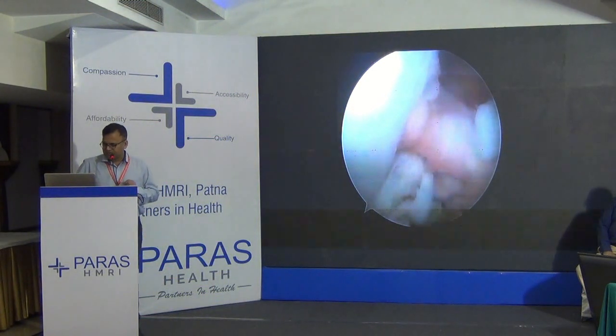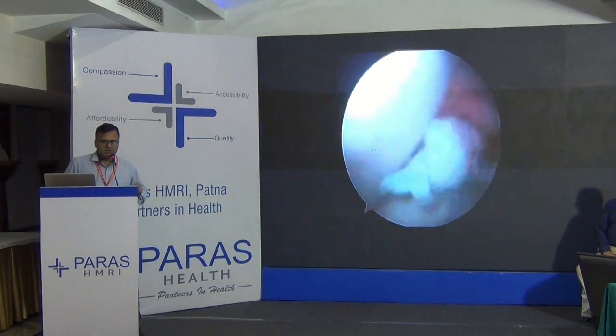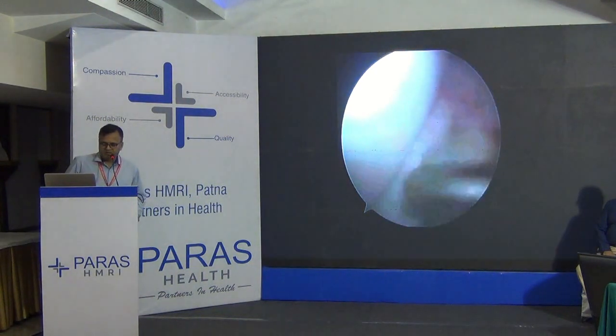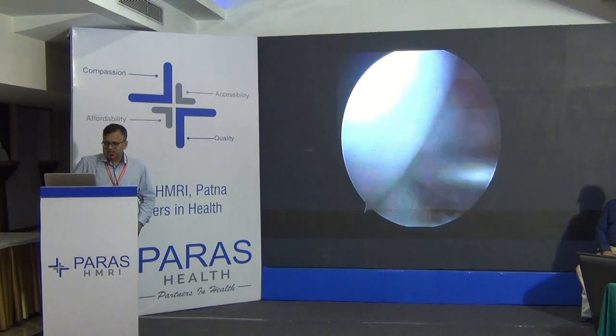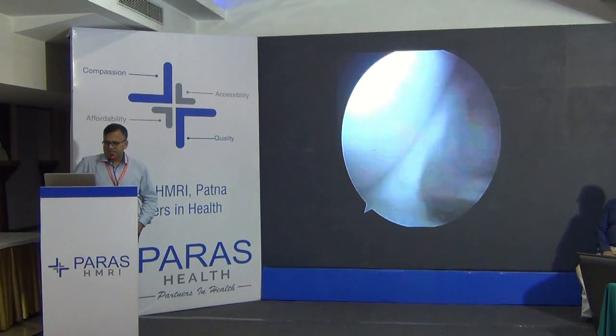So this is a quick video just to demonstrate how to do saucerization. This is the complete variety of discoid lateral meniscus in a 12-year-old child.